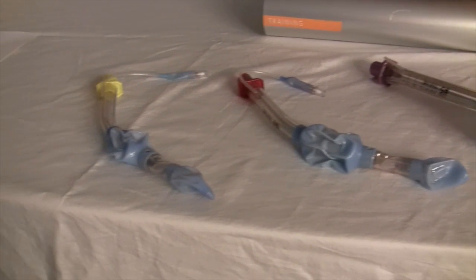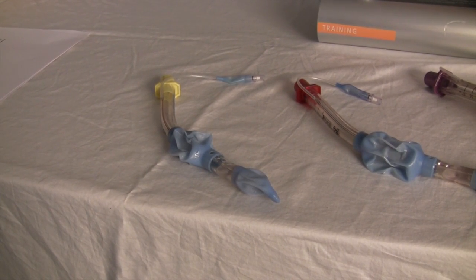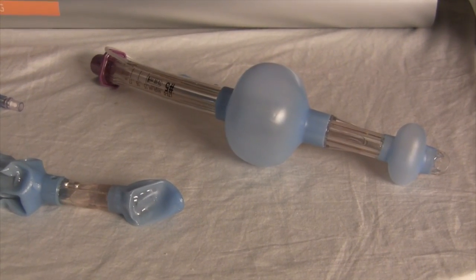The King comes in three sizes based on the height of the patient: a number three for those four to five feet, a number four for those five to six feet, and a number five for those over six feet.